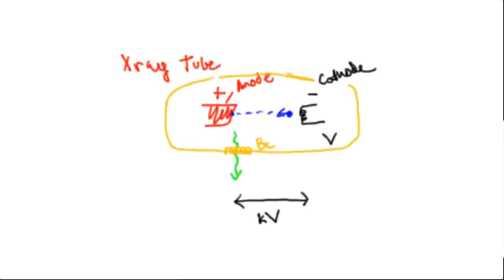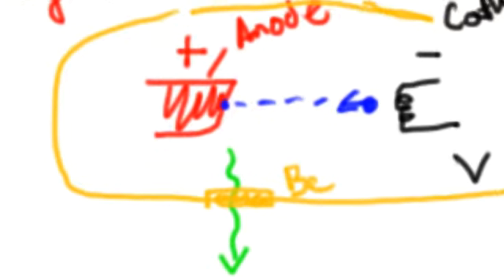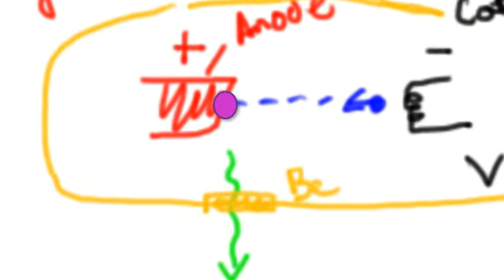So let me start by drawing a source here. And you'll remember what the source looked like. That's an X-ray tube, right? And you can go back to video 8.1 to review that. So you have an electron accelerated towards an anode that produces a photon, and there's your source, the spot there. And it has some finite size.